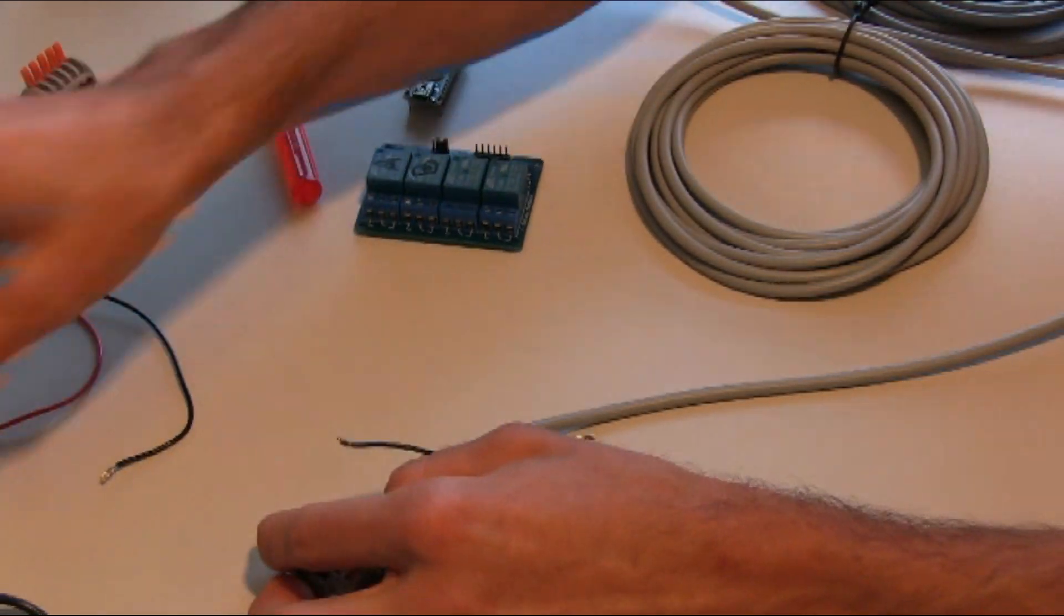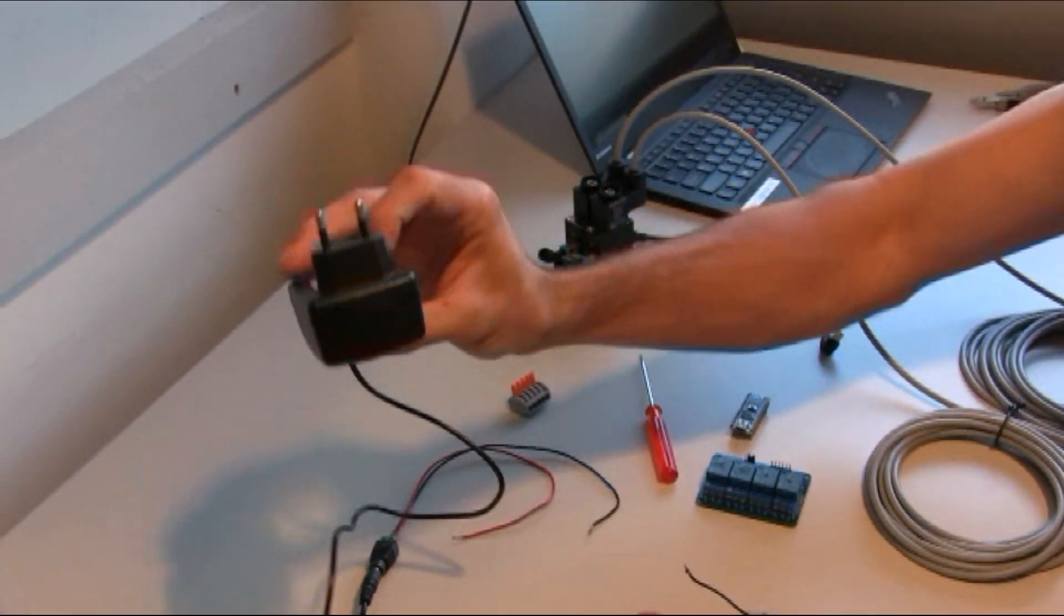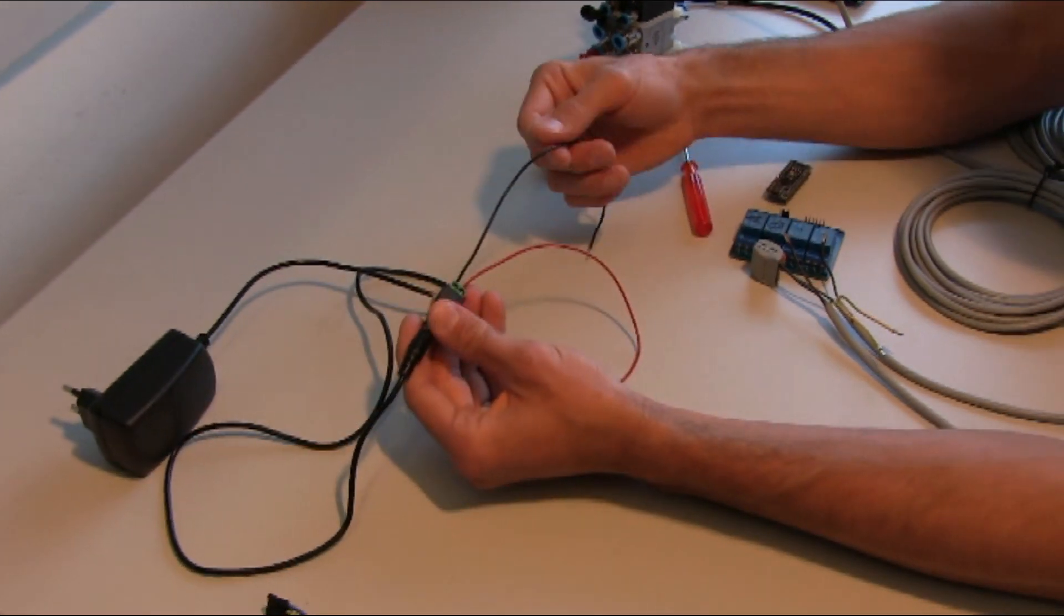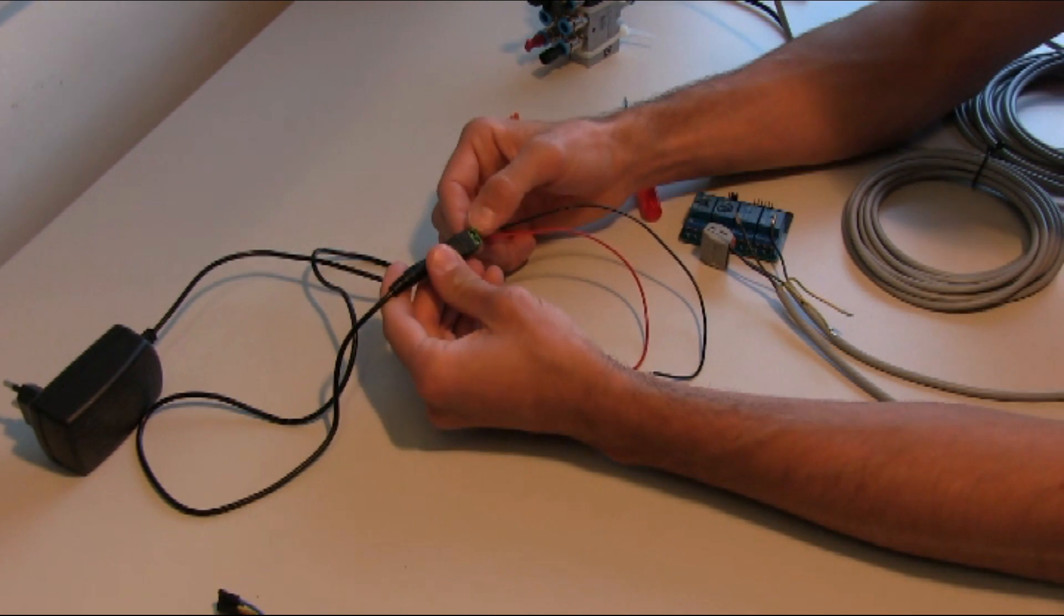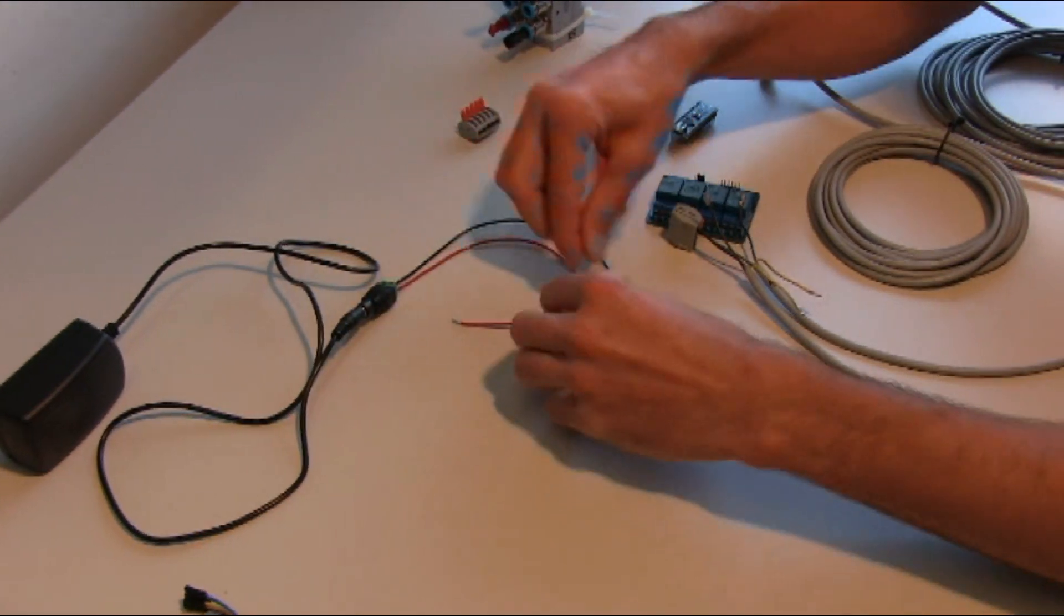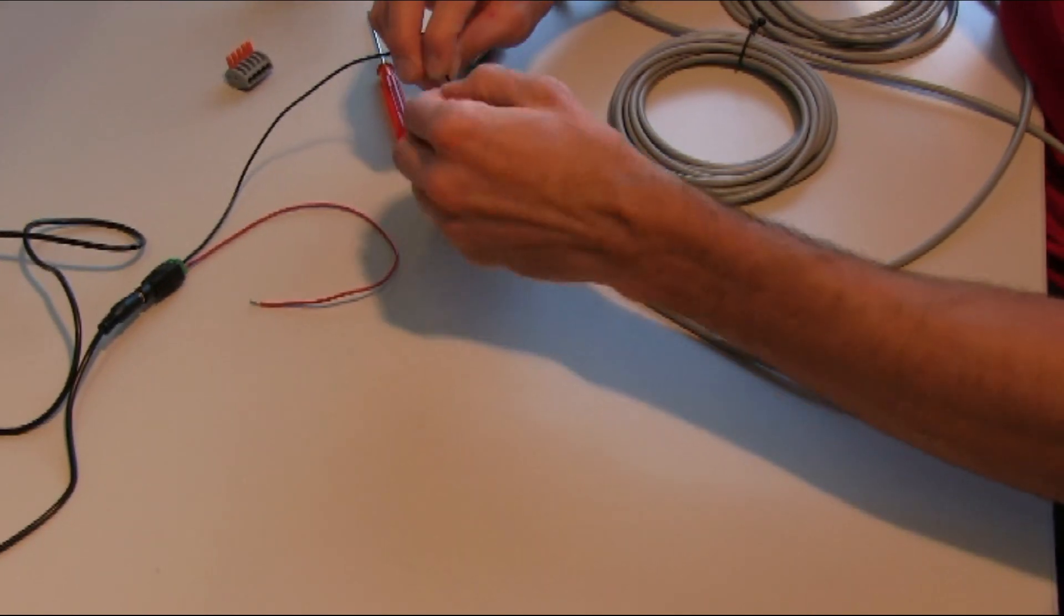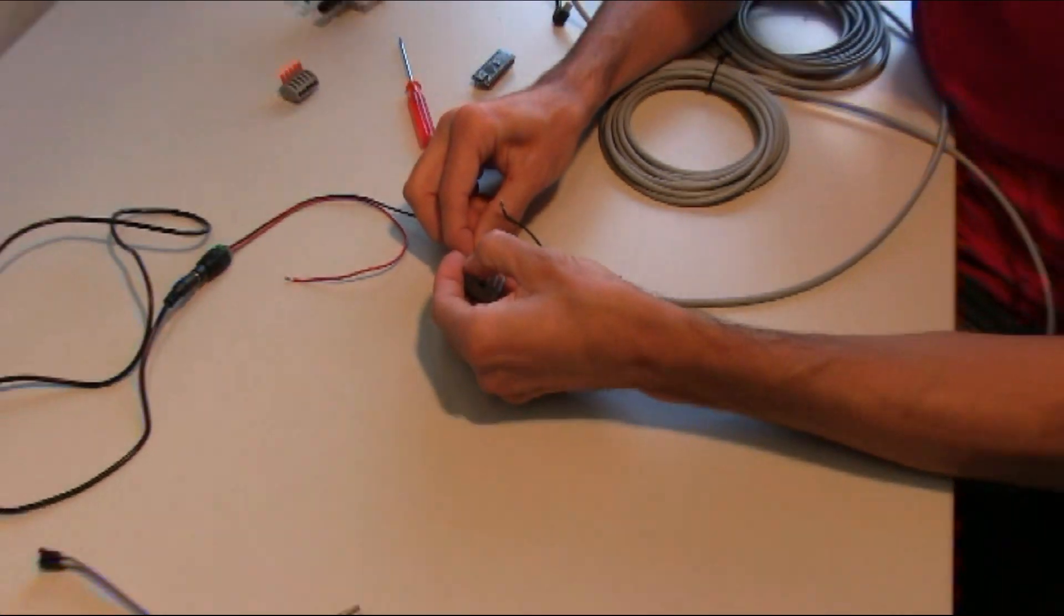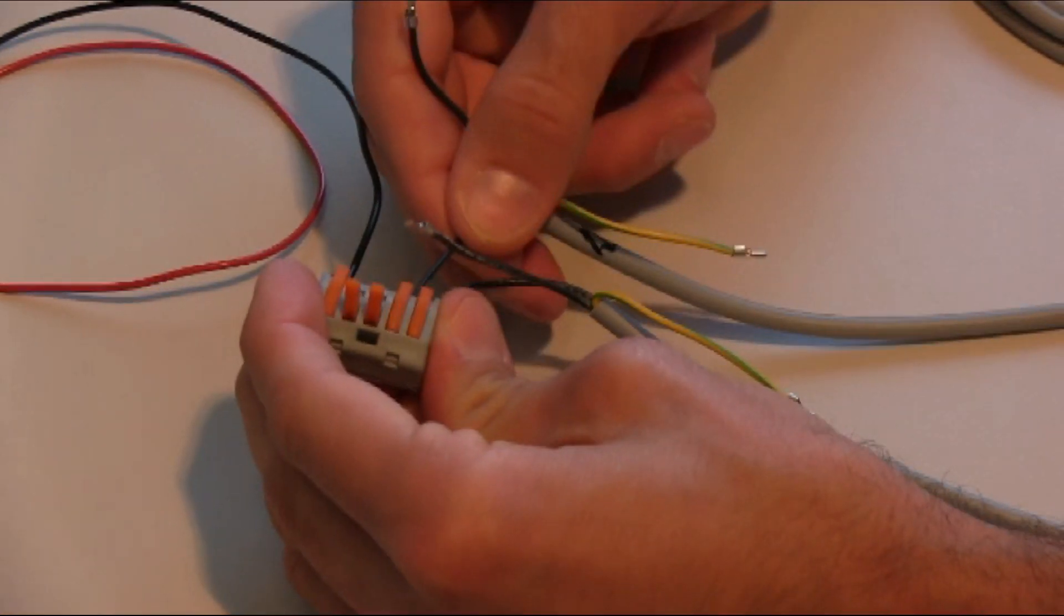And then we take a 24 volt power supply, where we have connected a black and red cable. The black cable is the minus, and the red cable is the plus. We take the minus, the ground line, we connect it into the header. Okay, we check that the connections are nice and tight.